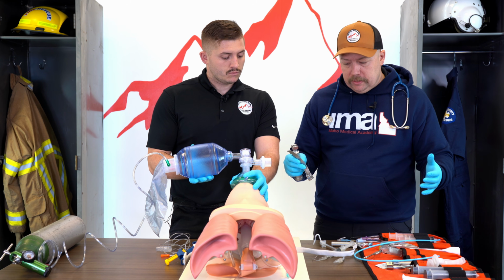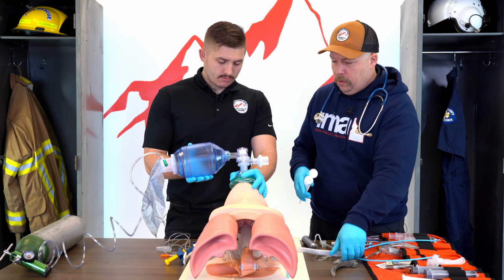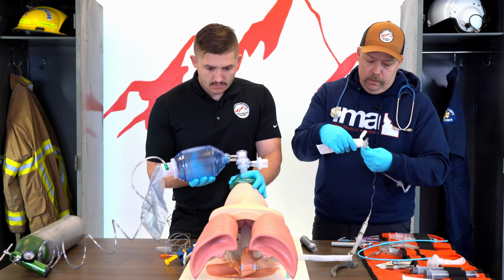So we have everything set up here. I'm going to do a little bit more lube just to make sure that we're all set there while Cody does this, and then we will be ready for the procedure.